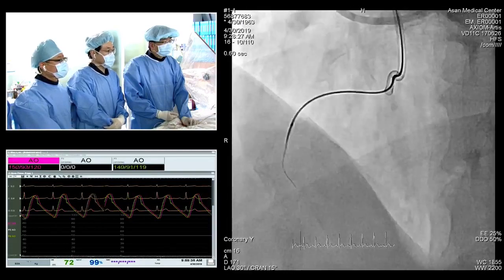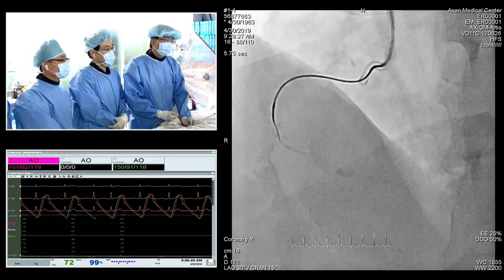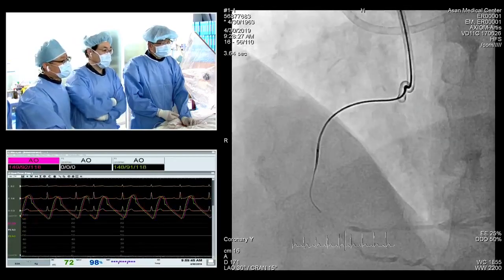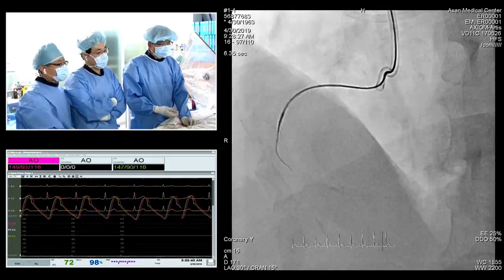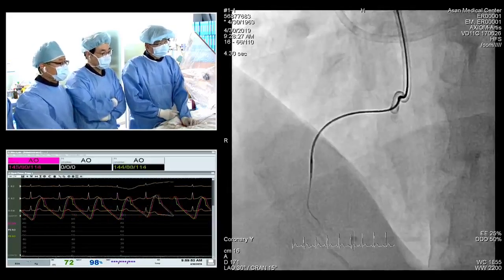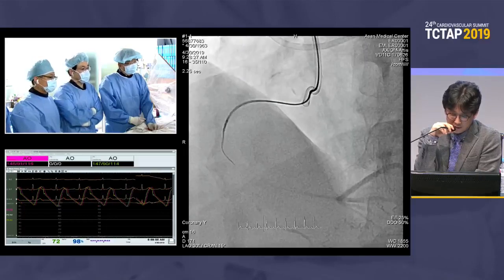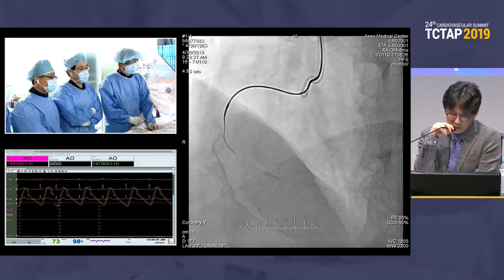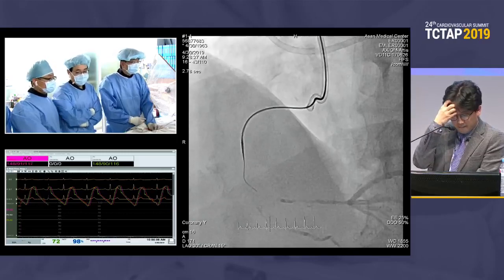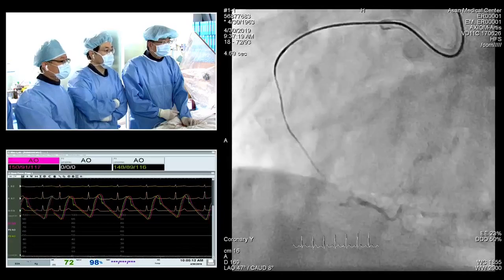Next. So angiography, maybe RCA wire is going, yes. So it's at least in the right way in the vessel. Yeah. At this time you can use a double lumen catheter if you opt to. So if the wire is in a different vessel, then it's better to redirect the wire and put it in the right vessel. Next, please. So I advance more, and next.